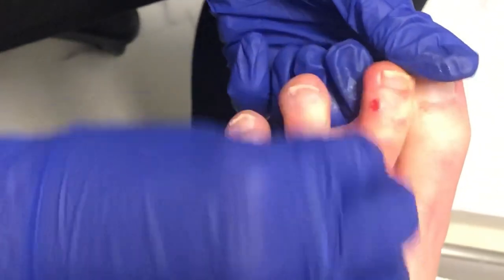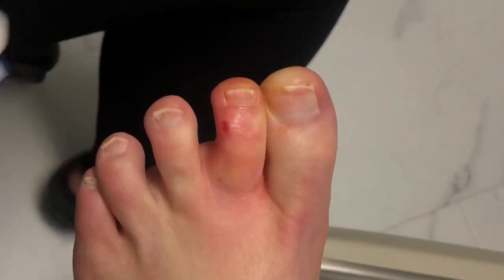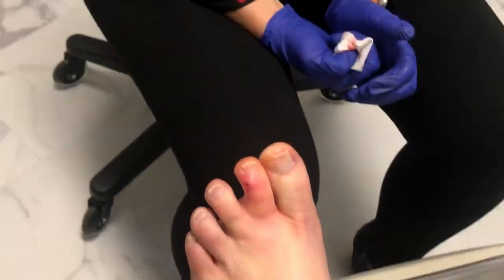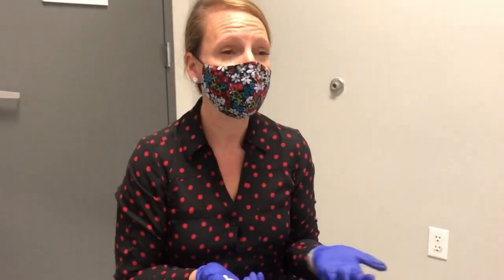What I normally do at this point is inject a little bit of steroid into it. I want to go into that joint that you irritated when you bumped it, and that's going to help make sure we get it to kind of shrivel this whole thing up and hopefully keep it from coming back. It may not completely, but it gives us a better shot than if we don't do it.